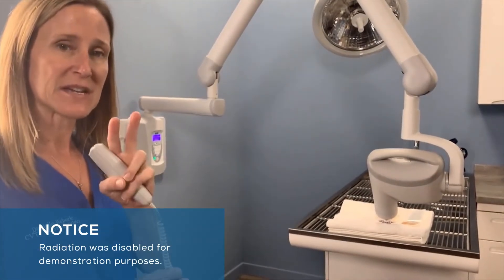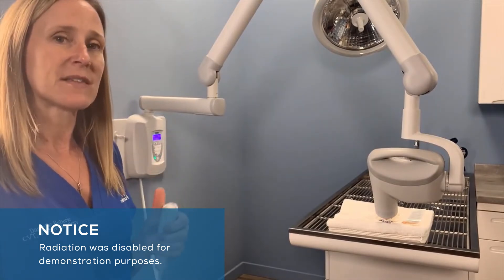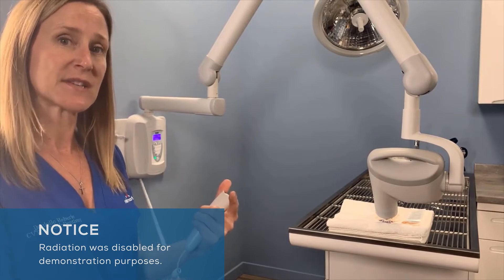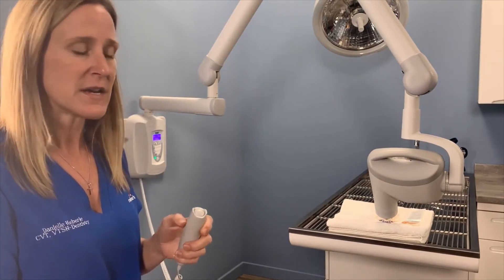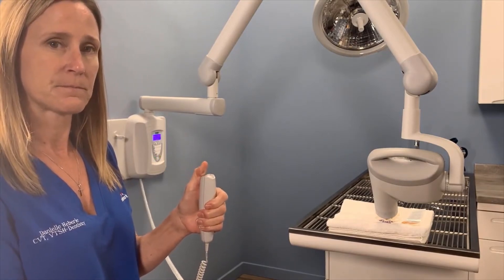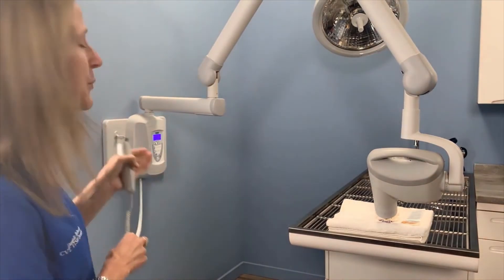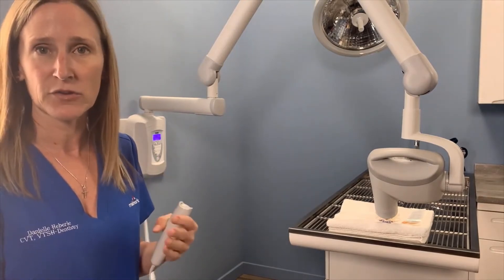I'm going to take two acquisitions here. First, you're going to see that I let up on the button a little too early, and it's going to give us an error message. The second time will be the right way. You'll notice the generator beeped and it says pre-termination error, which means we just let up on the button a little too early.